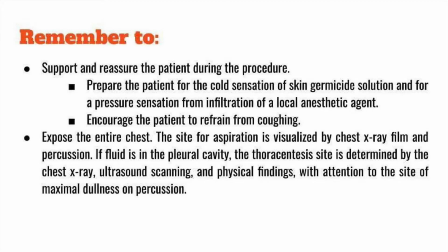Always remember to support and reassure the patient during the procedure. Prepare the patient for the cold sensation of skin germicide solution and for pressure sensation from infiltration of a local anesthetic agent. Also, encourage the patient to refrain from coughing.